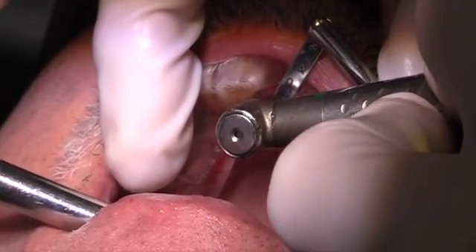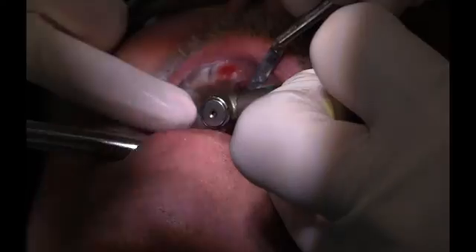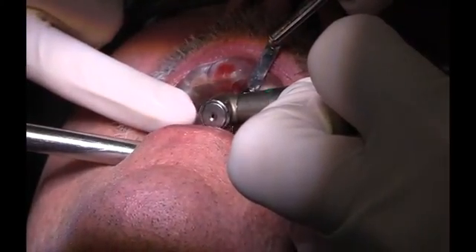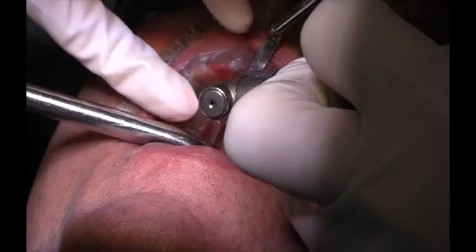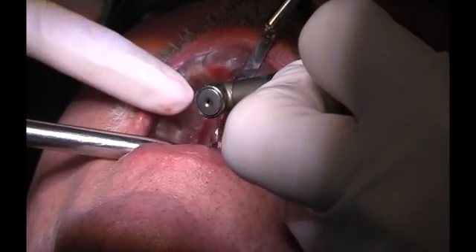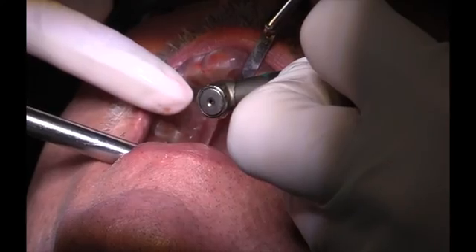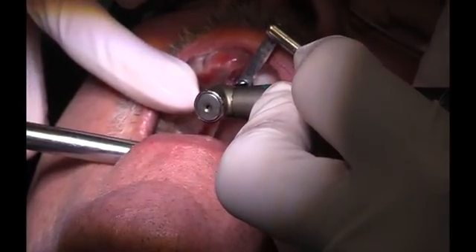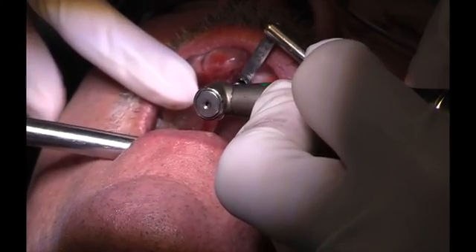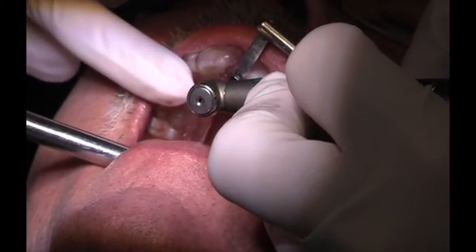Getting into a position that's ideal for the temp shell and for supporting soft tissue, we'll put the second drill guide in and gradually widen the osteotomy without generating a lot of heat, using nice sharp drills for a very precise cut to protect the bone. Water is carried by the drill, so we don't want to drill at high speed. With the third drill guide I've decided not to go to the full 13mm based on the feeling of the bone — I just want to go slow and be very precise.